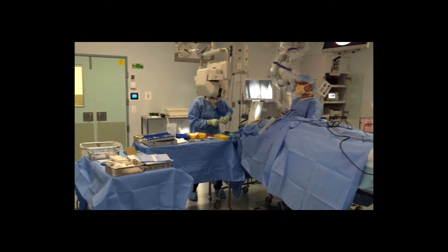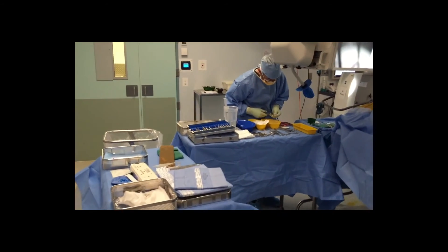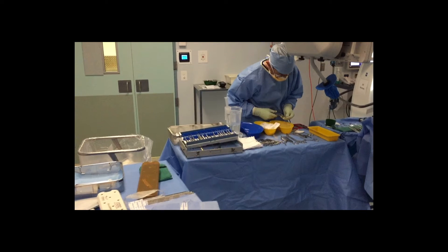Typically the most commonly used instruments are placed closer to the surgeon, seen on the right hand side of the screen, and the least used — such as the drill and more uncommon instruments — to the left.